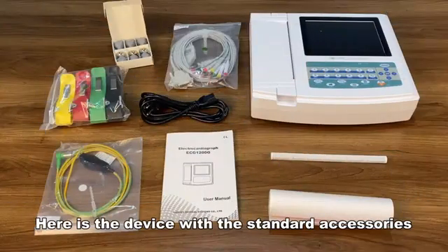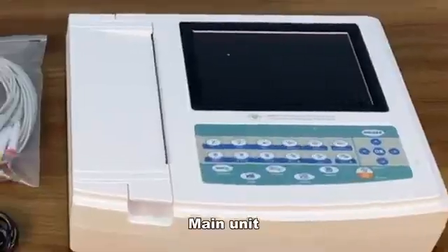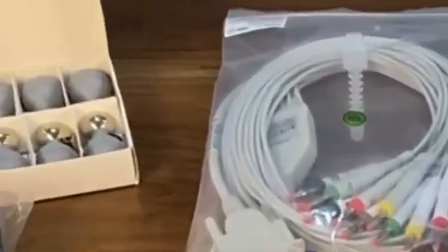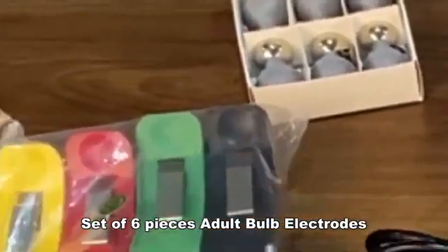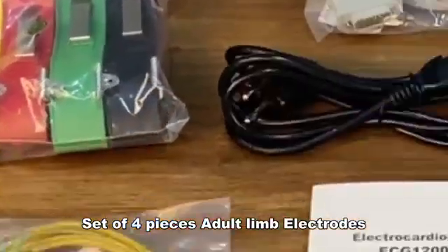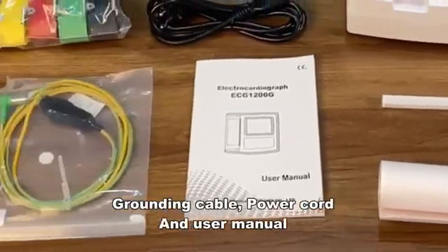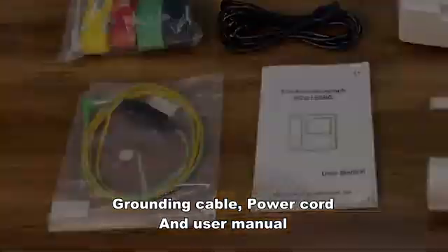Here is the device with the standard accessories: main unit, 10-lead patient resting ECG cable, banana clip, set of 6 pieces adult bulb electrodes, set of 4 pieces adult limb electrodes, the thermal recording paper with roller, grounding cable, power cord, and user manual.